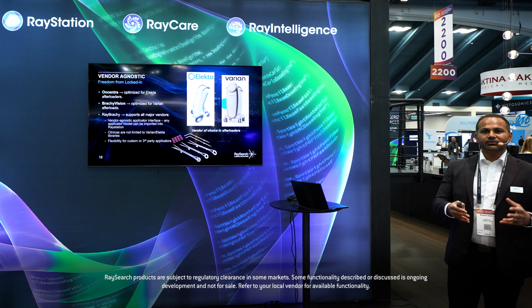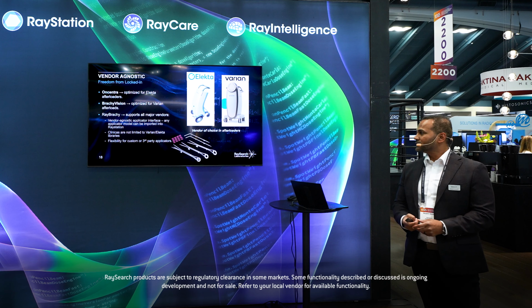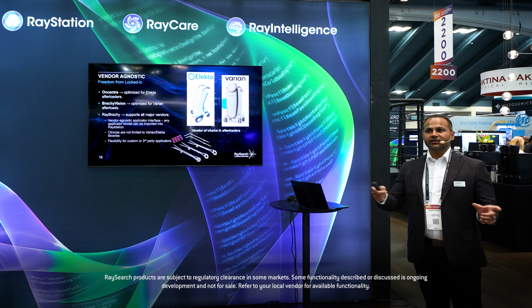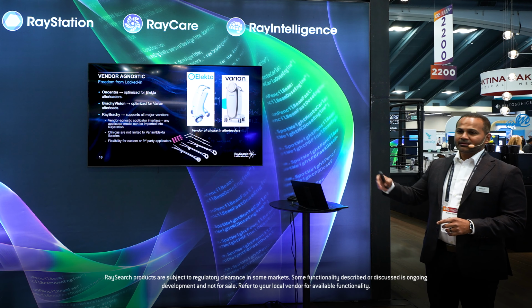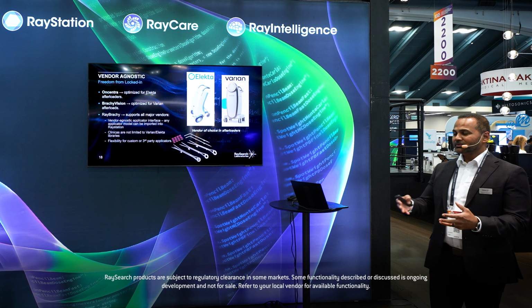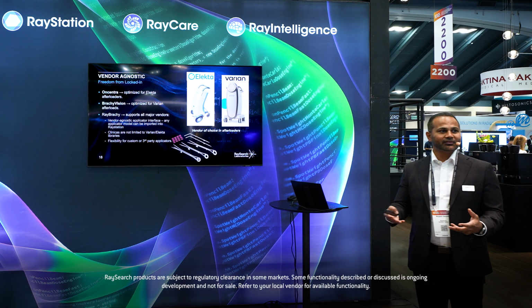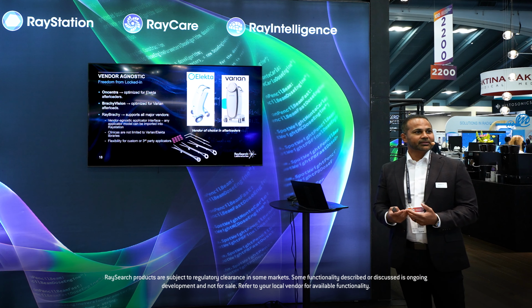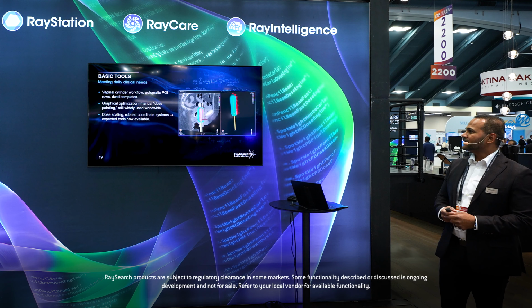You're not limited by any of those vendors, so you can choose what's best for the patient and what's best for your clinic. The clinics aren't limited to those Varian and Elekta afterloaders; you have the freedom to do that. RayStation supports flexibility for any of those vendors or third-party applicators. So we have clinics who may want to do 3D printed applicators. Not a problem. You can bring that into RayStation and make use of that as well. A really great tool for that.